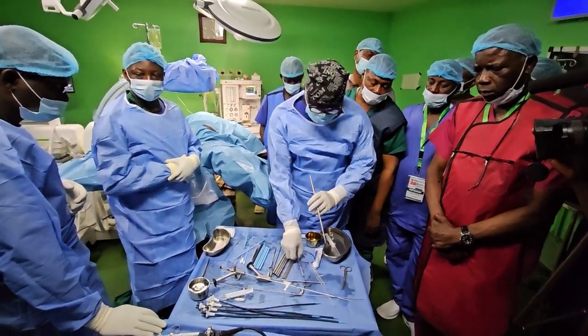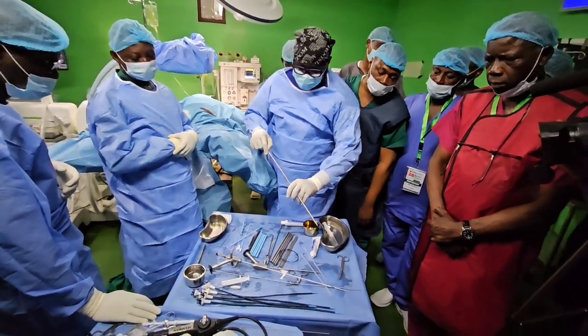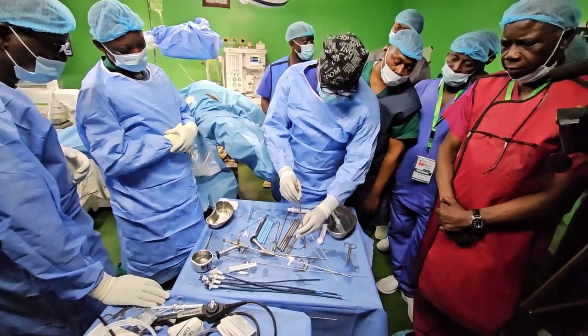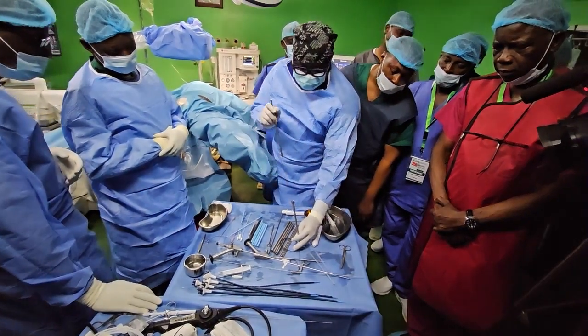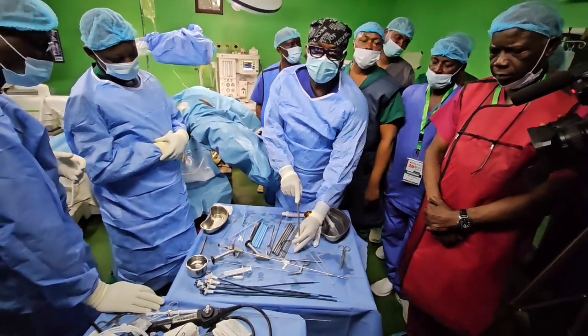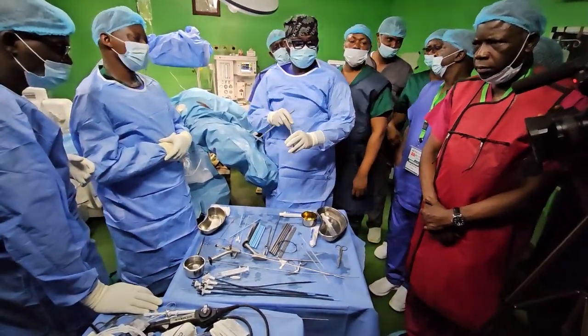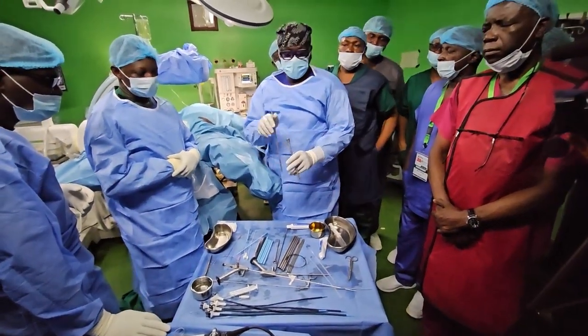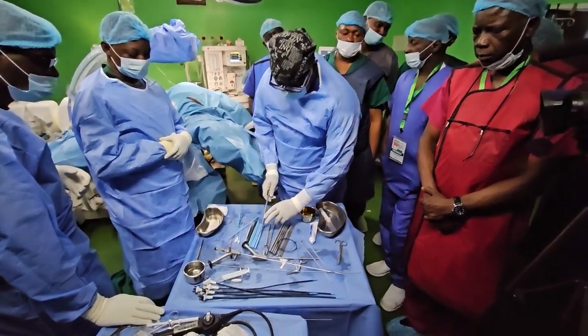After that you put the Amplatz sheath. You can put it this way. Then it goes over down, and then you remove this and leave the guide wire in. Always leave the guide wire in, because sometimes when you get into the system, it won't direct you. So that is about dilatation.